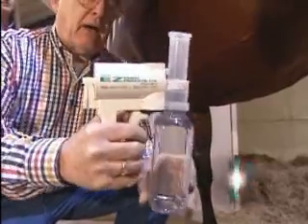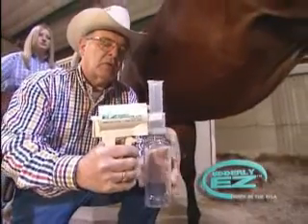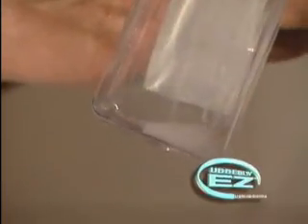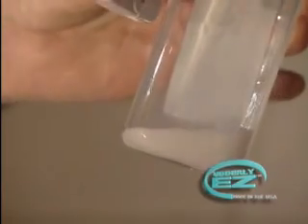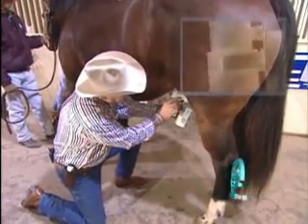As we go up underneath this bag, it's very critical — just tilt this bottle back a little bit towards the pump because it's a vacuum pump. That has to be held up against there. As we go up underneath the teat, make sure that it's centered and start the pumping process. After about the third squeeze, it should start to draw the milk, and here comes the colostrum. As long as the milk is running, stop pumping. When it slows down, you can start pumping again. To break the seal, simply tilt the bottle back towards the pump handle — it releases the vacuum and comes right off the teat.